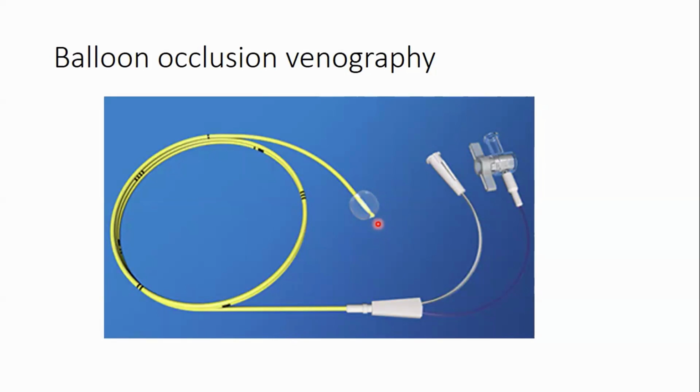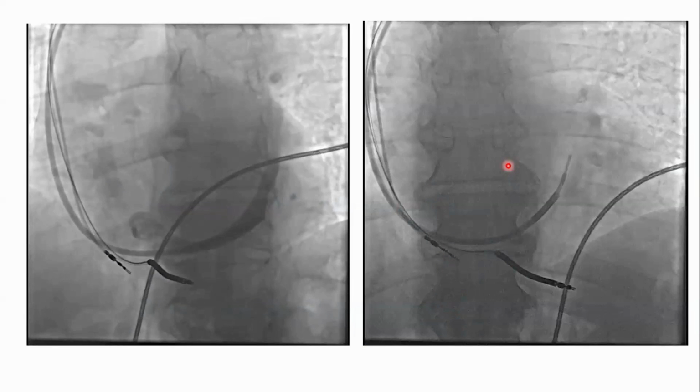So the best way to advance this catheter is to advance it all to the tip of your guide and then fix it in position and withdraw the guide. So sort of desheath it rather than to advance it. And that's a safe way because that means you're not going into unknown territory. So once your balloon is in the coronary sinus body, then you inflate it. Usually it comes with a syringe and you just inflate it with air, and you can usually see it once it's inflated. And once you do the inflation, then you can inject.